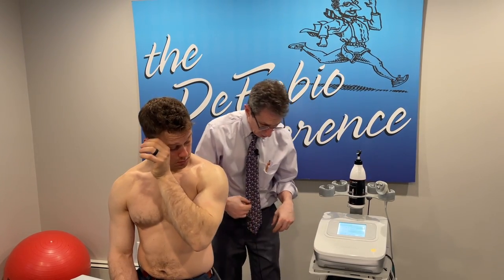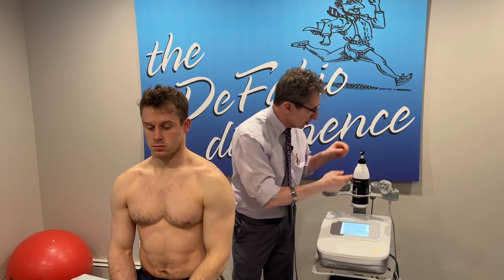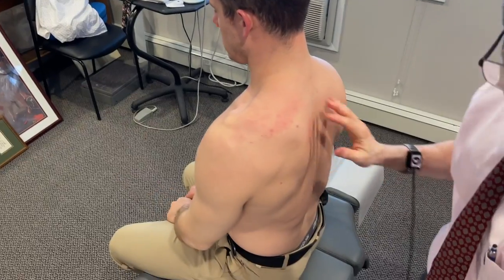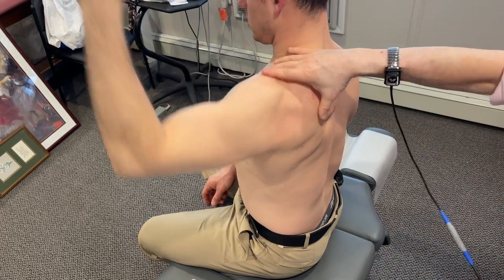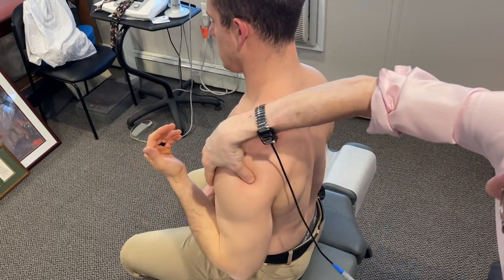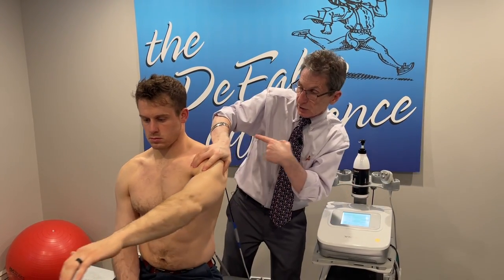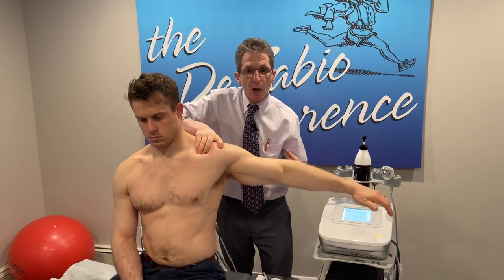What if I want to use my hands more? I do a lot of myofascial release — something called active release. So I can use my hands; now it's hooked up to me and the therapy is going to come through me and right through my hands. I have to be careful that I don't generate too much heat, but it'll come right through my hands. Let's do posterior capsule — go straight across. I'm doing active myofascial release, pin and stretch, with therapy coming through my hands. I'm not using my other hand because it's connected over here — it doesn't have to go through my body any more than it needs to. He's working; I'm working.